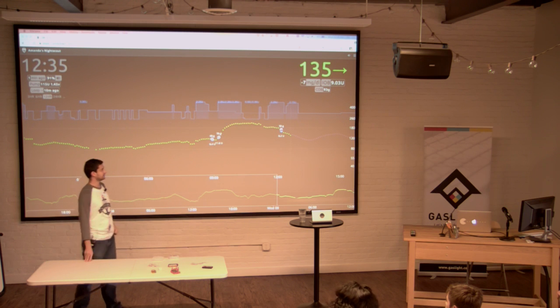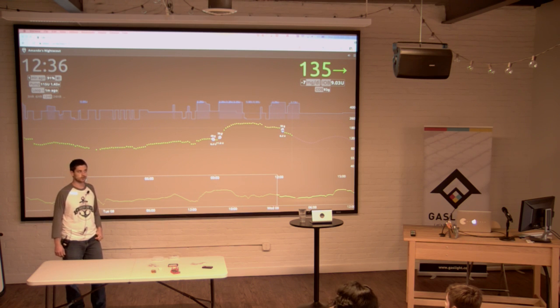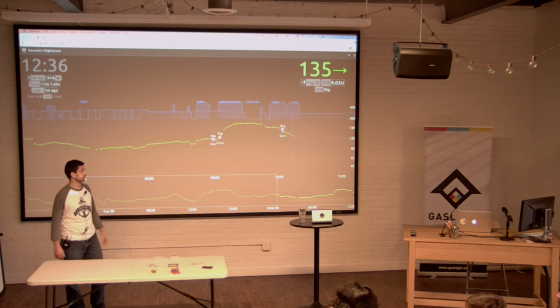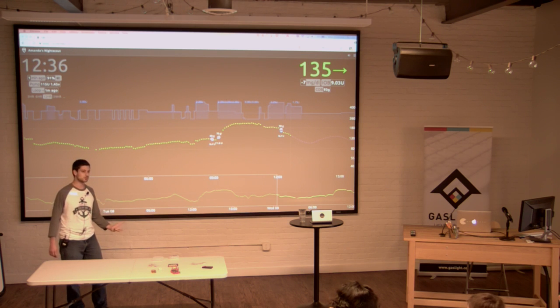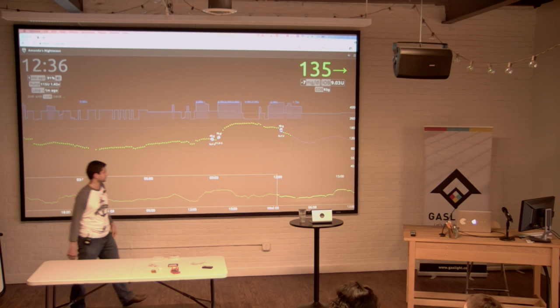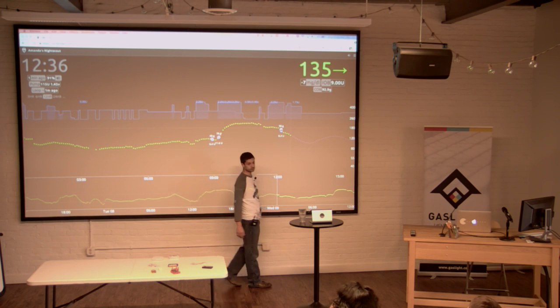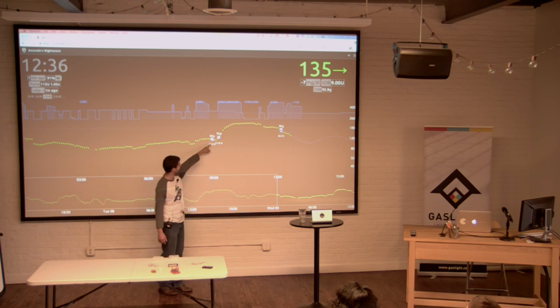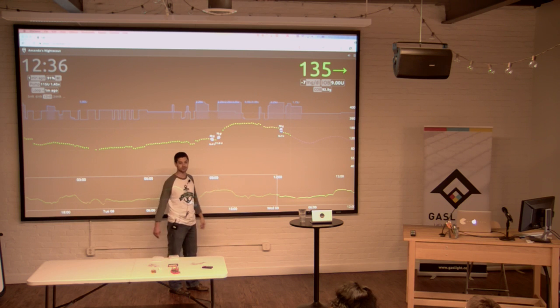She's entering carbs as she's eating. One of the features of the Loop app is that you can actually tell it what kind of carbs they are — different carbs affect you differently: fast-acting carbs and slow carbs. She's entering that through the app saying 'these are the carbs I'm about to eat, deliver this much insulin.' You can see here she said she ate 50 grams of carbs and took 8.2 units of insulin for that — probably dessert or something.